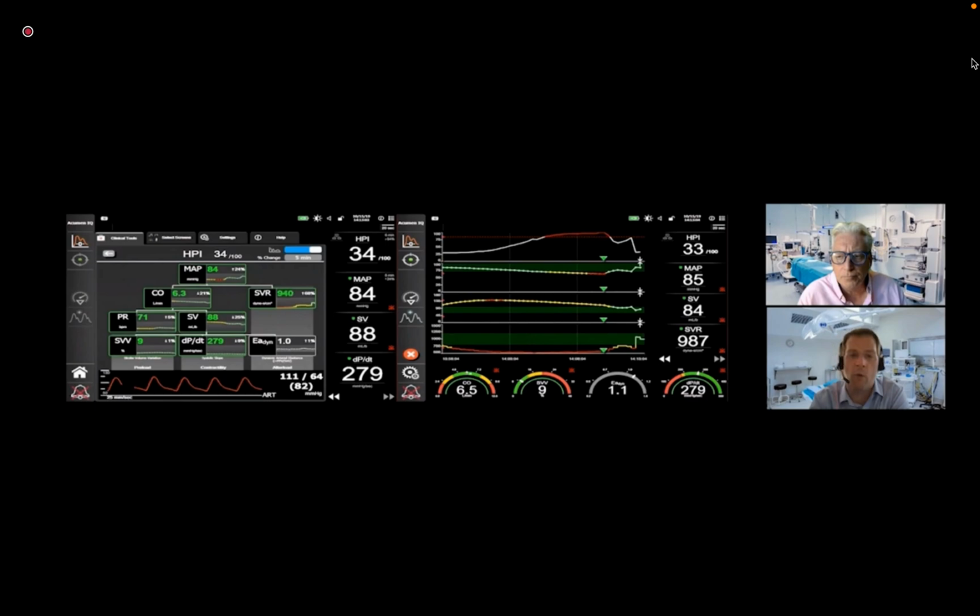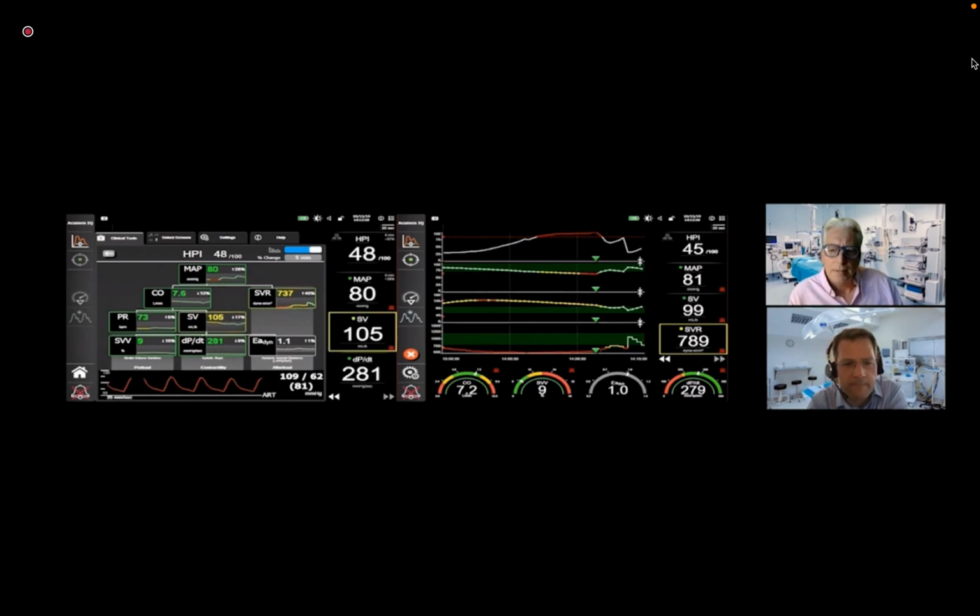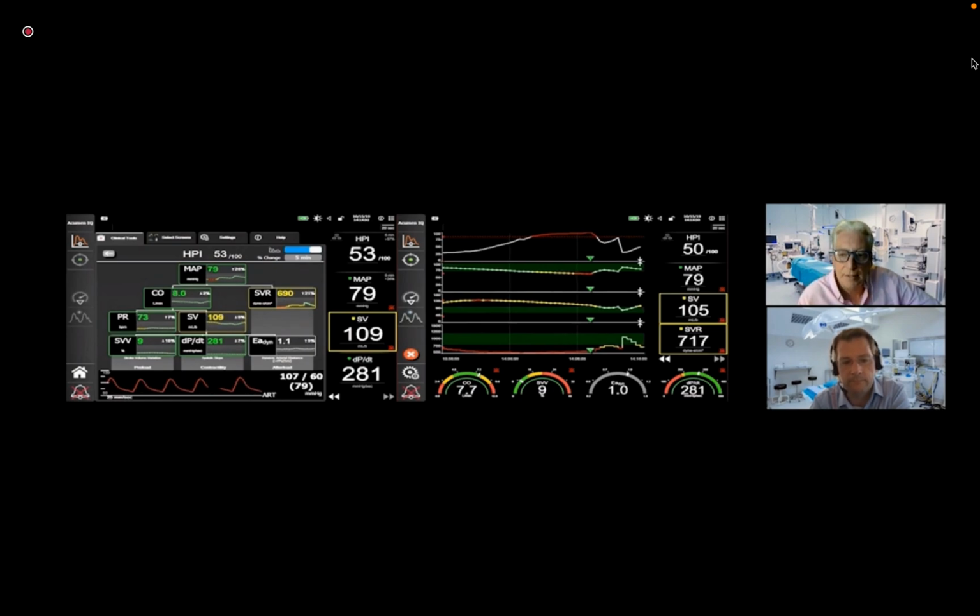Absolutely. So when we gave the vasopressor, we were not volume responsive. We'd filled up the model beforehand, and we've given this alpha agonist, and we've seen an increase in our SVR and also in our mean arterial pressure. Interestingly, Monty, Ea dyn hasn't changed. Yeah, and you wouldn't expect it to under this circumstance. You just said you're not preload responsive. Ea dyn is the dynamic elastance, so it is a component of afterload, the stretch of the vessel component of it. But here under this scenario, you would expect just an SVR and MAP change predominantly.